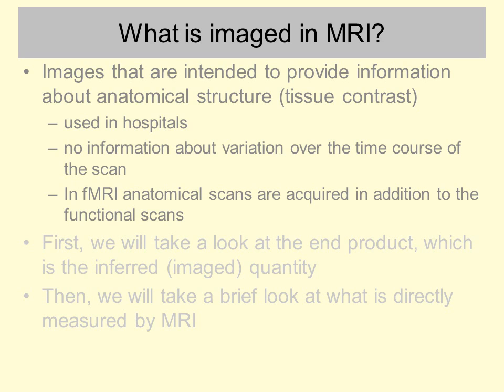And when you're doing functional brain imaging, you also acquire the anatomical scans in addition to your functional scans, because your functional scans contain only relatively coarse information about anatomy. You want to also make use of MRI images that contain good information about the anatomy of your participants, and then you'll be able to co-register the two types of image, which we'll see in the workshop.